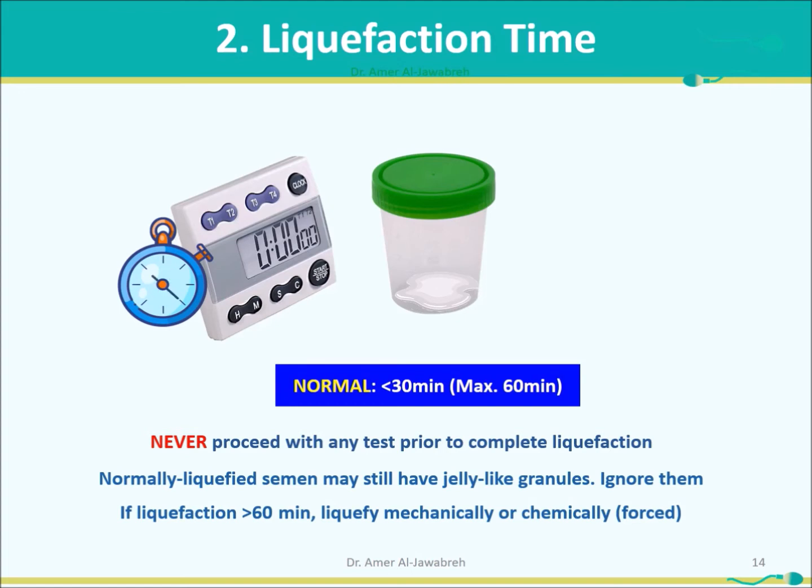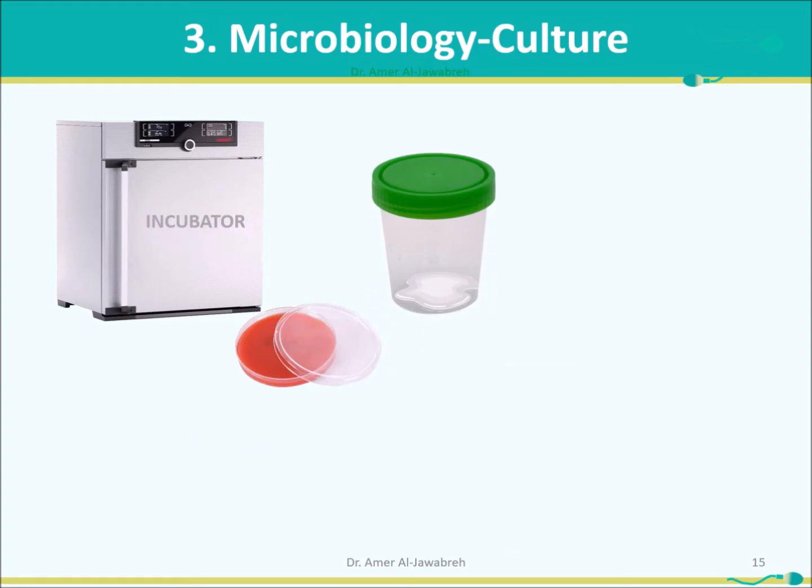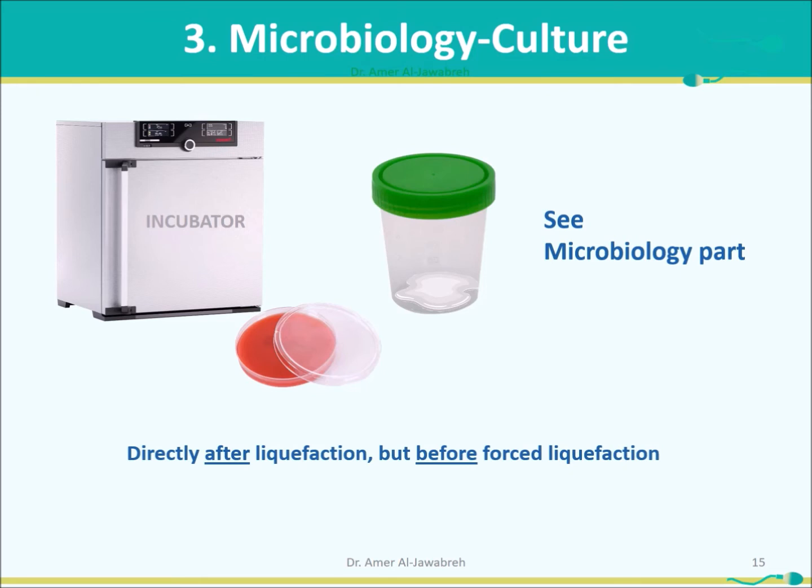Forced liquefaction. If culture is requested, do it now, before forced liquefaction. Microbiology, culture: see microbiology part. Directly after liquefaction, but before forced liquefaction.